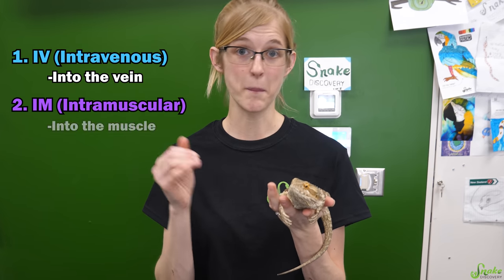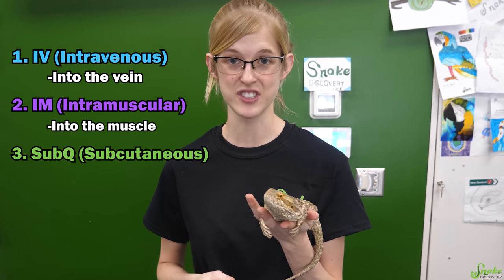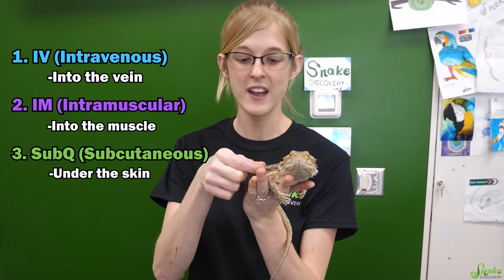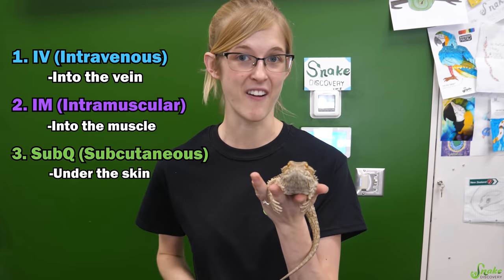which is delivered into the muscle tissue. And finally, you have sub-Q, or subcutaneous injections, which is an injection given just below the epidermis layer, or the skin layer, in between the skin and the muscle tissue, so in that thin little fat layer area.